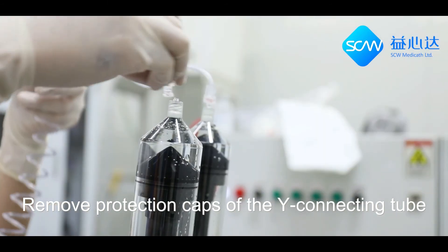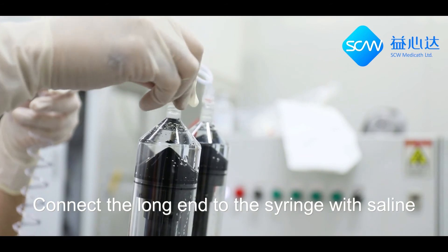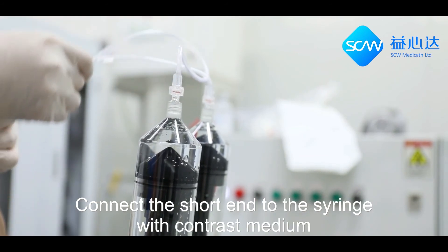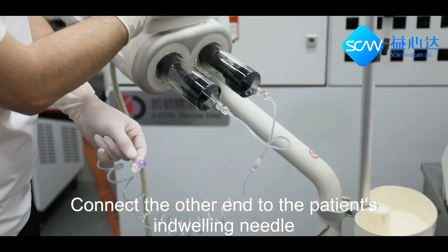Remove the protection caps of the Y-connecting tube. Connect the long end to the syringe containing normal saline. Connect the short end to the syringe containing contrast medium.